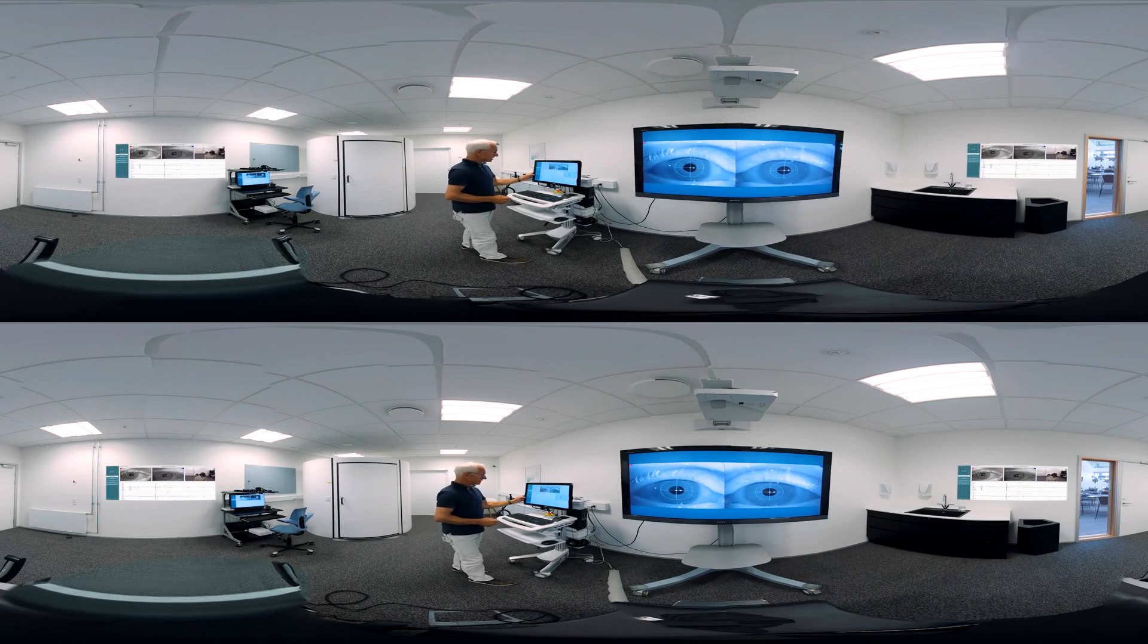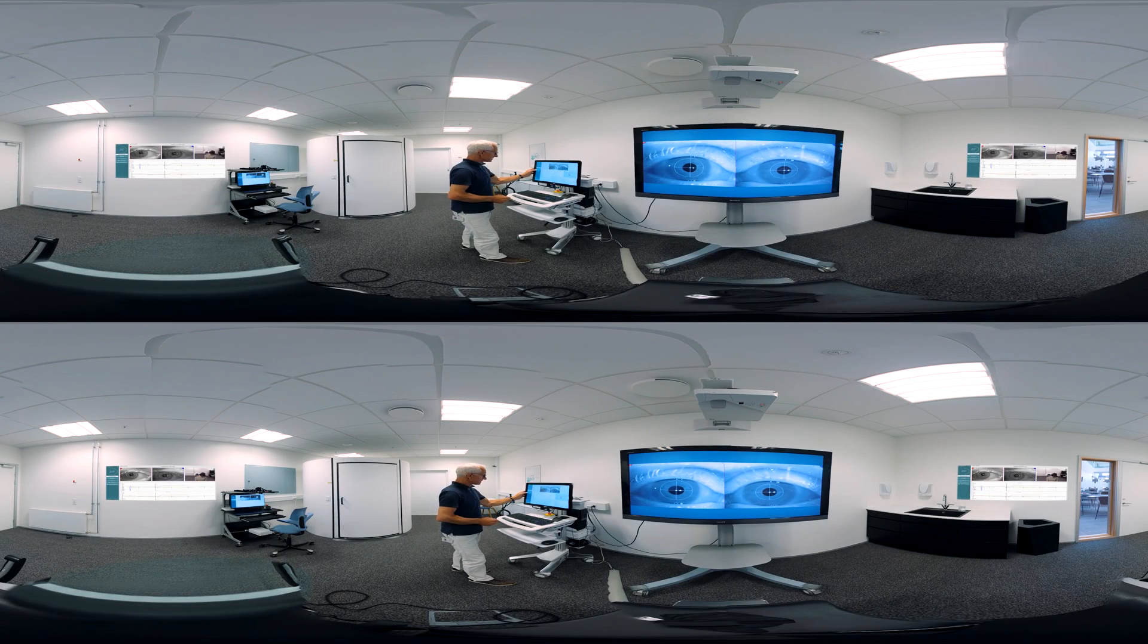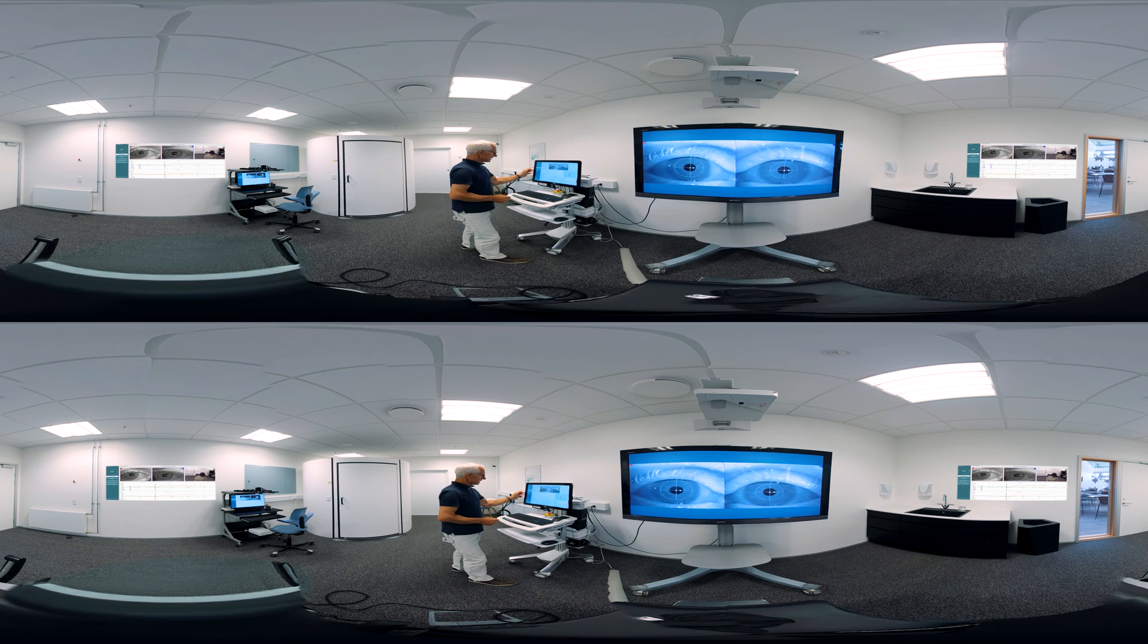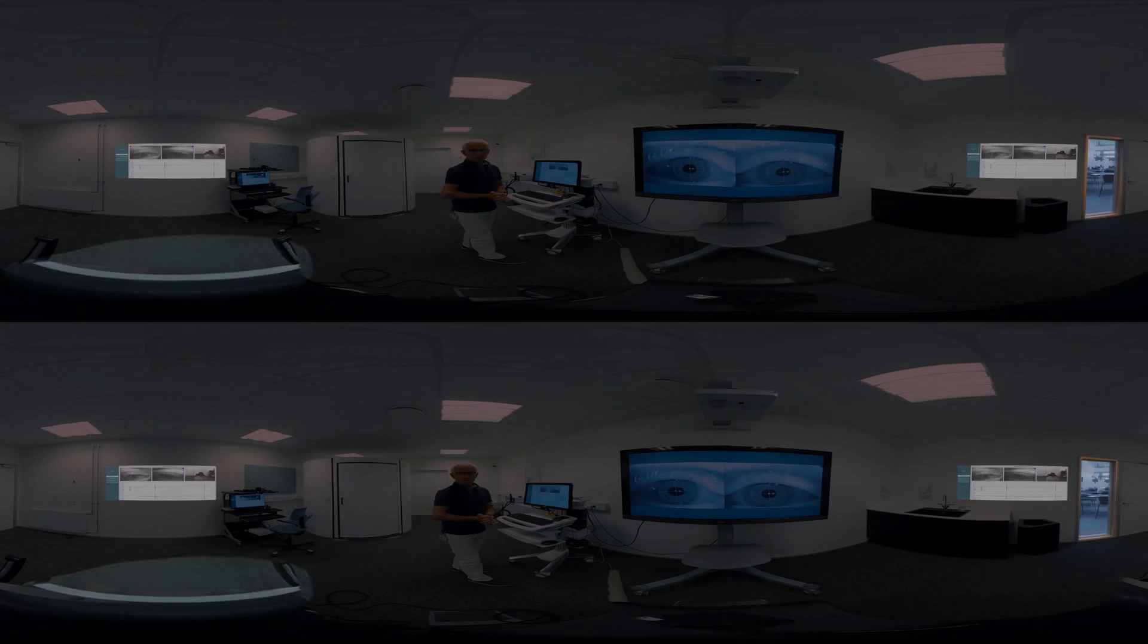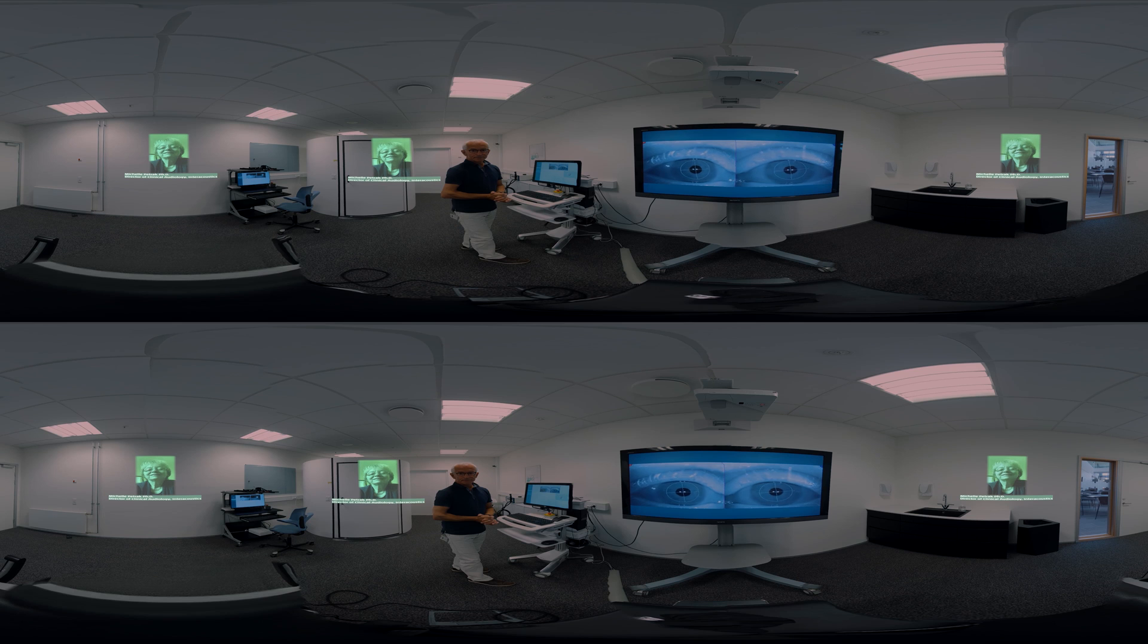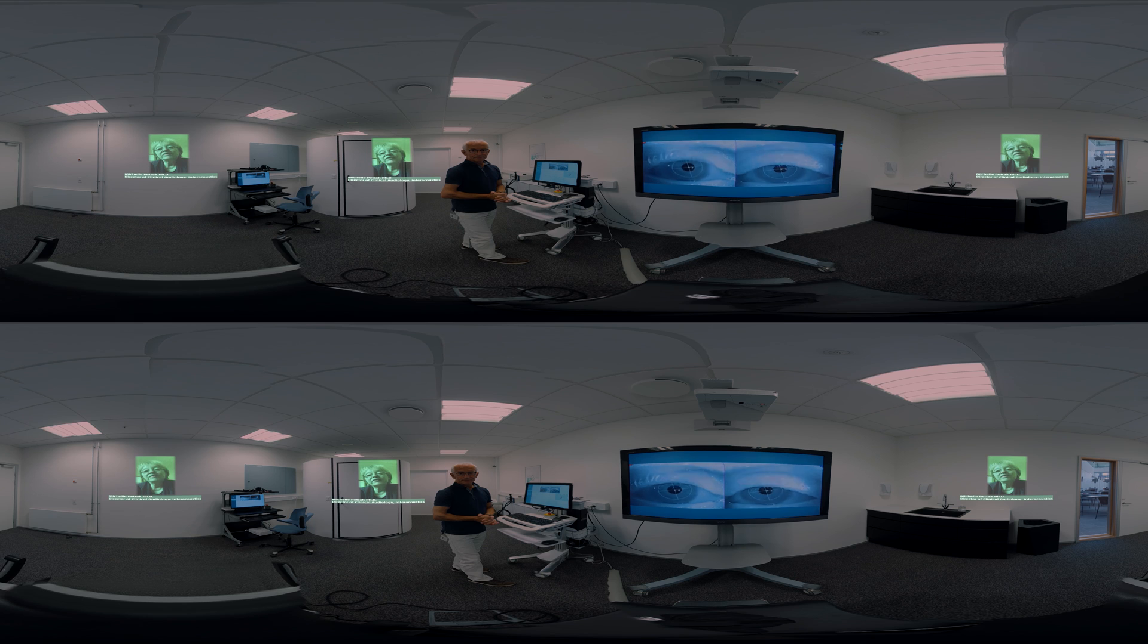All together, Visualize is the single most comprehensive battery of balance tests on the market. Michelle, you are the expert. Can you tell us more please? Visualize 3.0 is bringing so many new opportunities to our clinics.